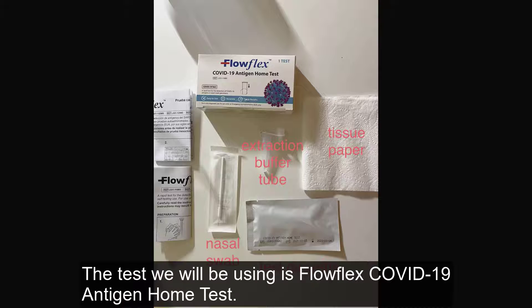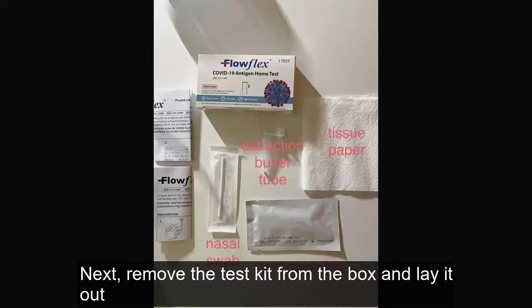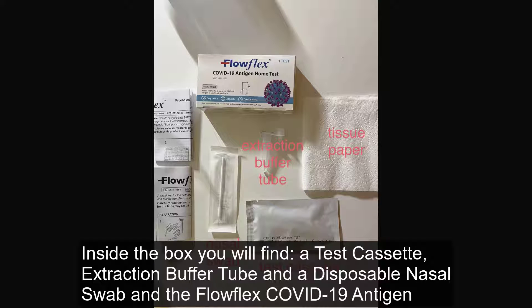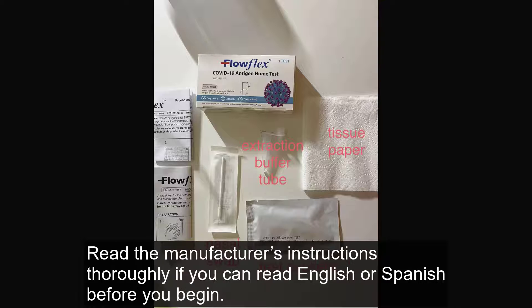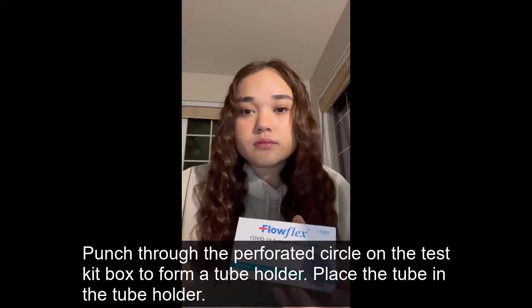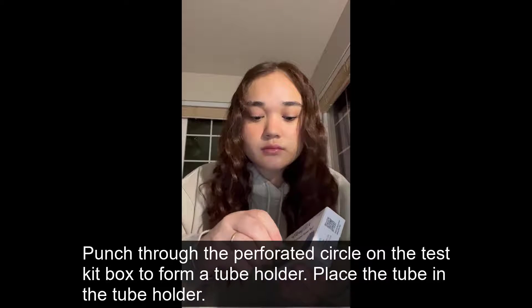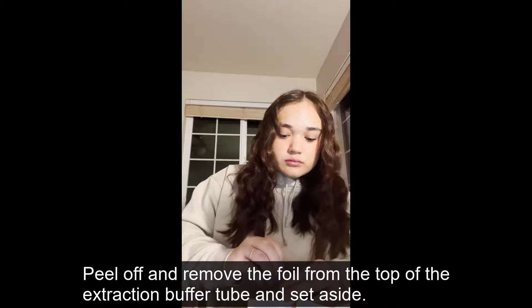Step 2: Preparation. The test we will be using is the FlowFlex COVID-19 Antigen Home Test. There are other brands of tests available, so be sure to follow the manufacturer's instructions for your specific test. Remove the test from the box and lay it out. Inside the box, you will find a test cassette, extraction buffer tube, and a disposable nasal swab, and the FlowFlex instructions. You will also need a timer and a tissue, which are not included in this kit. Read the manufacturer's instructions thoroughly if you can read English or Spanish before you begin. Open up the cassette and disposable nasal swab from its pouch. Punch through the perforated circle on the test kit box to form a tube holder and place the tube in the tube holder. Peel off and remove the foil from the top of the extraction buffer tube, and set aside.